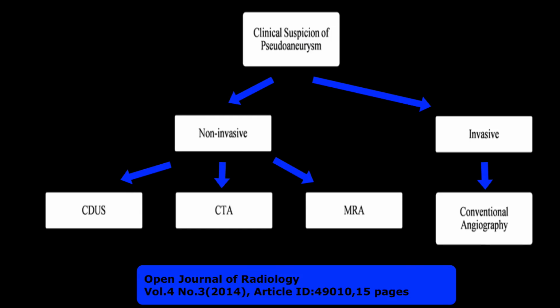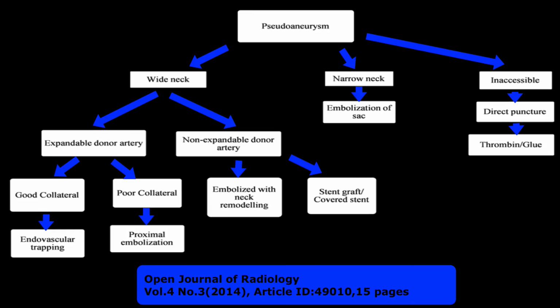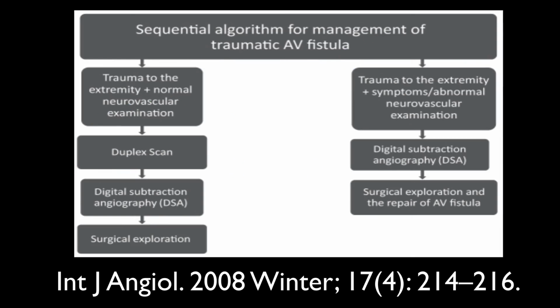It's great to identify these early with point-of-care ultrasound, and then typically the next step is to send these patients to radiology to get that full spectral Doppler analysis, and then you've got to get your vascular surgeons involved. Patients may need follow-up studies, may need embolization, or even surgical fix.